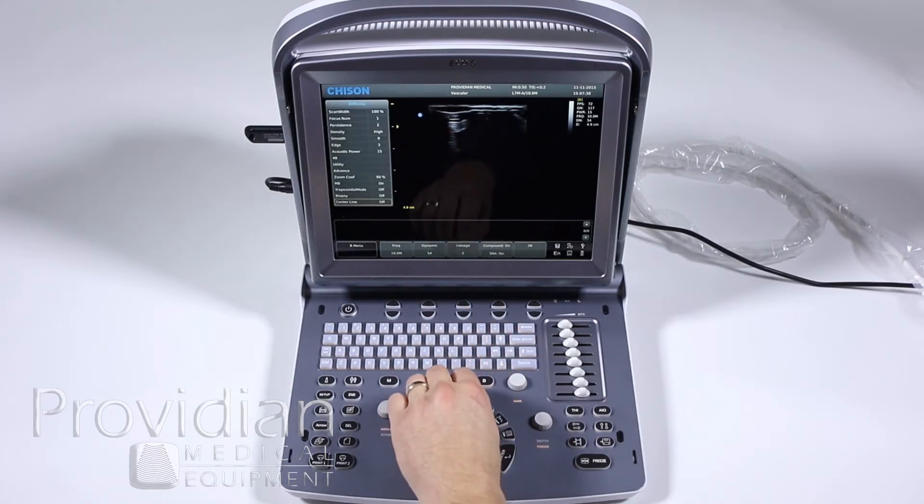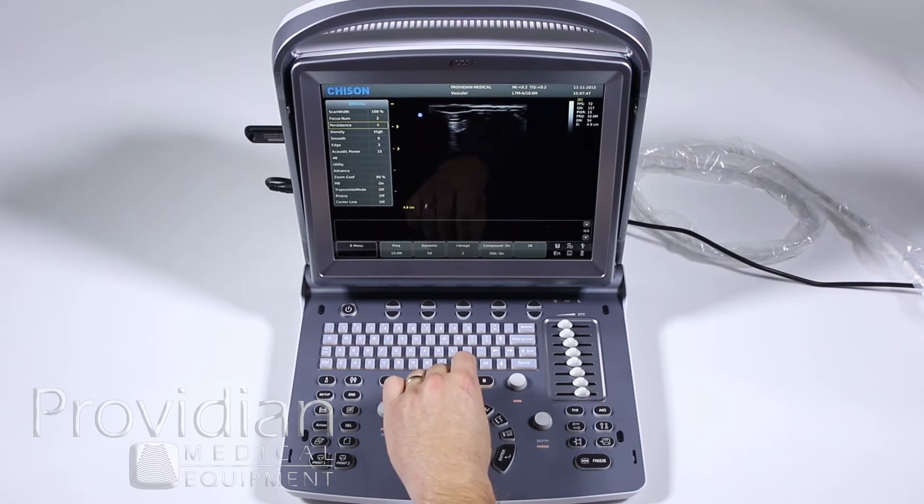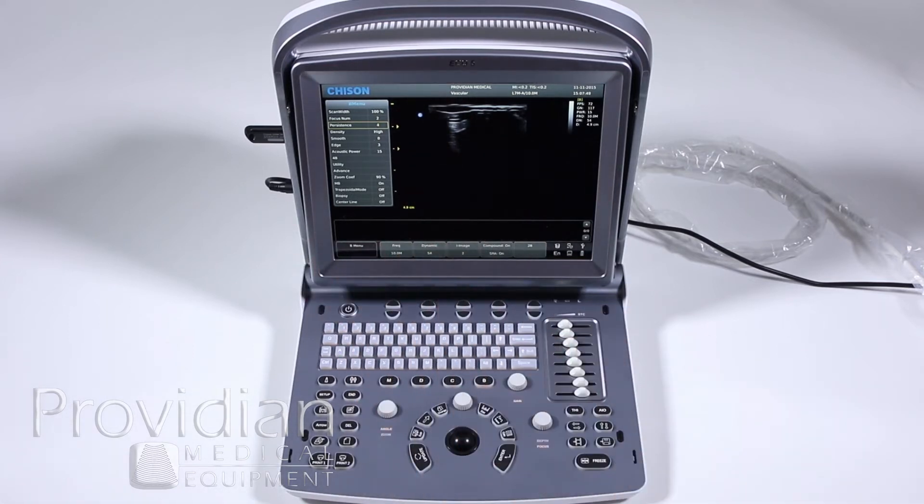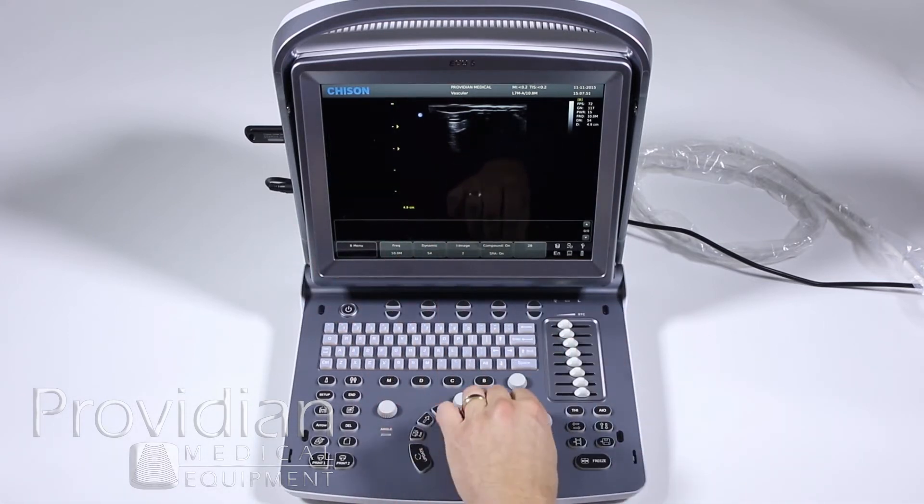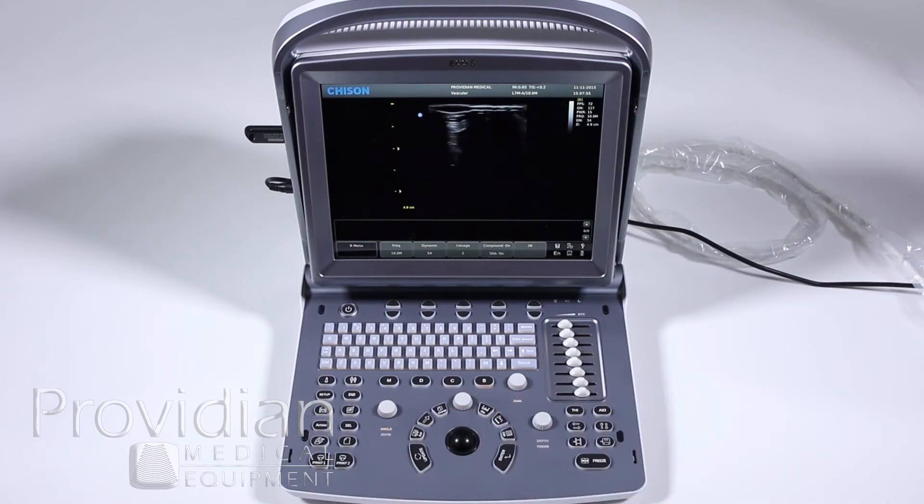I'm going to hit menu, say I want two focal positions, change my persistence and say I made some of those changes like that. I'm going to exit and I want to change my depth. I can now go ahead and save it so every time I choose a certain preset, all of those parameters are going to be set for me every time I start the machine.